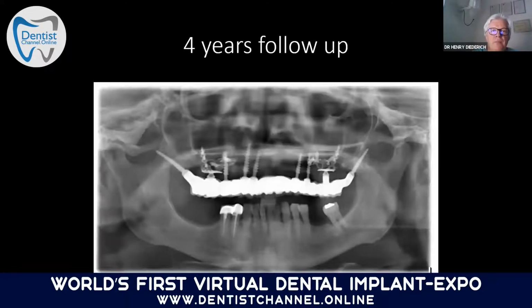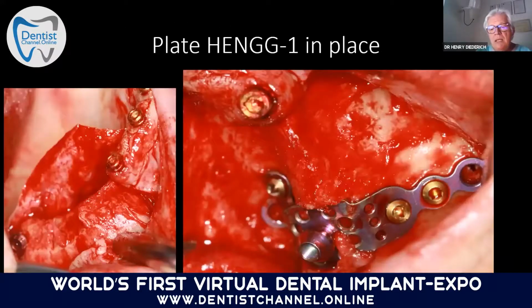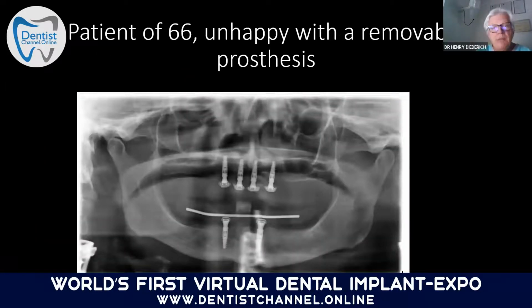lateral view. And here, 4 years follow-up, there was no problem, hygiene is perfect, no pain, no swelling, the patient is just happy. So that is excitement, because in a very short time, we may do a treatment plan, and we have a result. And that is what patients are looking for: a fast result, a minimum of suffering, and to have fixed teeth.